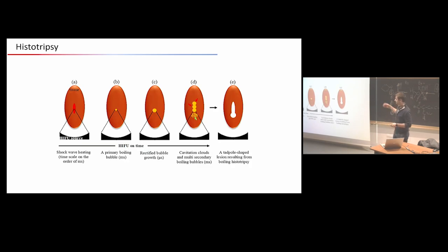So now I'm talking about mechanical effects. If you remember well, mechanical effects, we can obtain them by reducing the pulse length, just transmit very short pulse. Very short pulse, but at a very, very high pressure, much higher than what we are doing for thermal ablation. I'm talking about more than 20 megapascal. That is just huge. And when we do that, we create some bubbles inside the body. You are boiling, in fact, your body, and so you create bubbles inside.